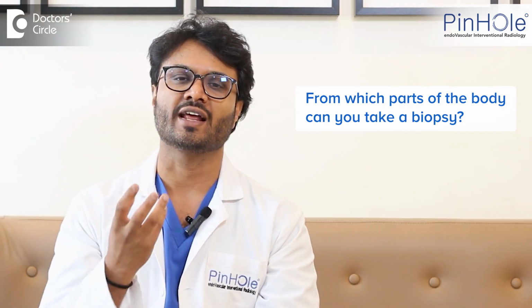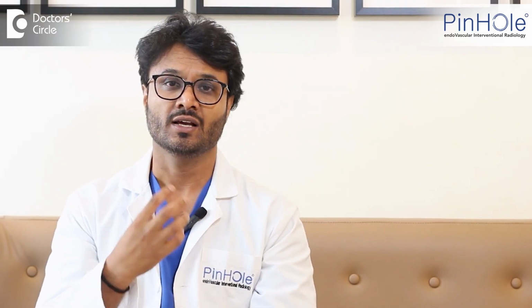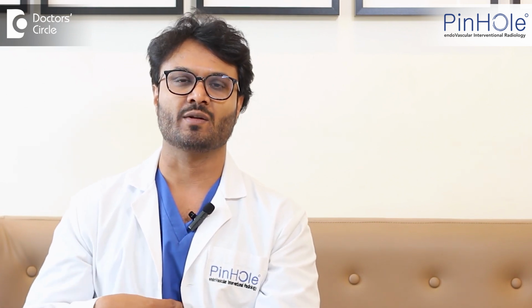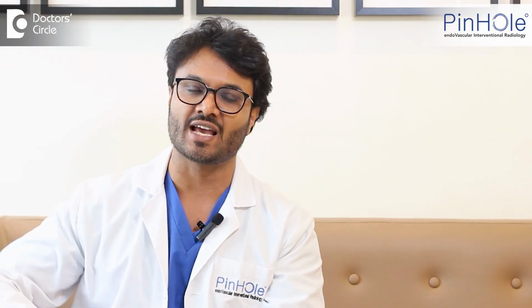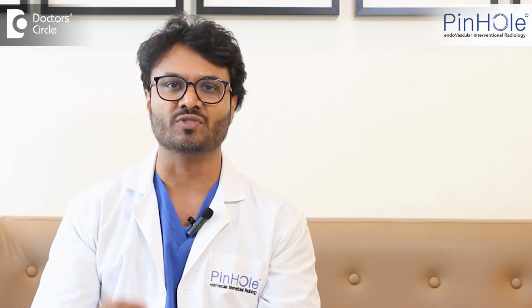From head to toe, like thyroid lesions, FNA biopsy, or neck lymph node biopsy, lung biopsy, mediastinal biopsy, liver biopsy, very commonly done day to day, some retroperitoneal biopsy, inguinal lymph node biopsy, axillary lymph node biopsy, breast lesions, which we do biopsy. For different areas of biopsies, we use different sizes of needle to get the tissue.